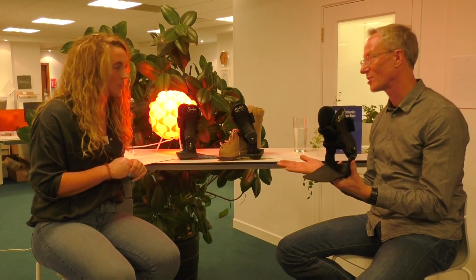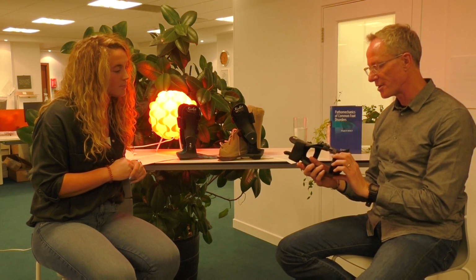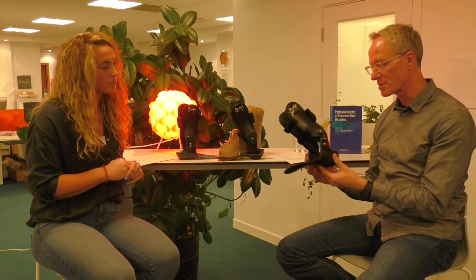Oh, because you wanted to fully offload. Just because of the pathology. Okay. So that was the key thing. The third type that we use is a Ritchie brace dynamic assist.